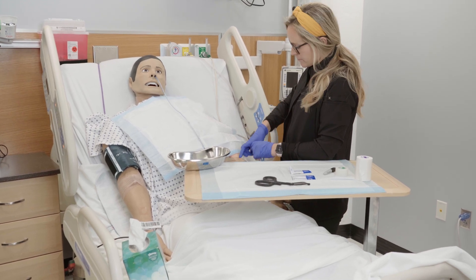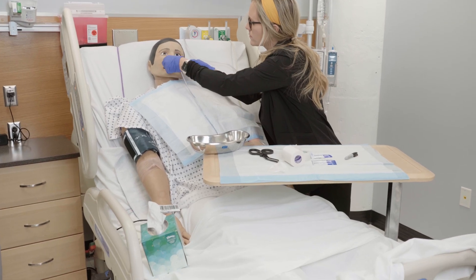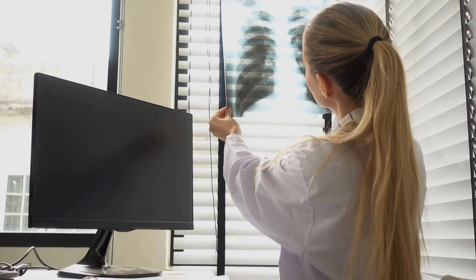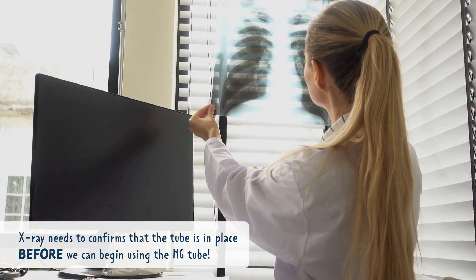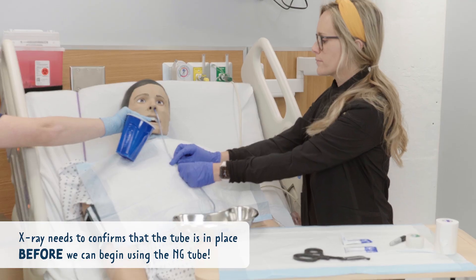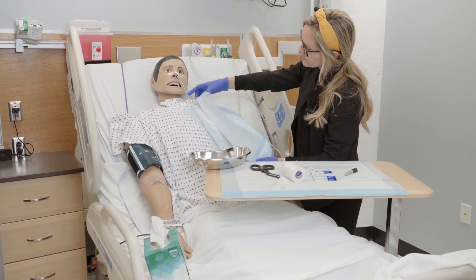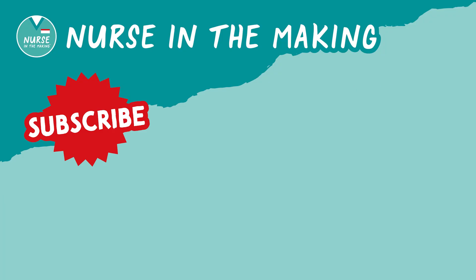Clamp the tube and secure it with a nasal bandage so it doesn't move around. It's important to know that an x-ray needs to confirm the tube is in place before we can begin using the NG tube. And that's how you insert an NG tube. If you need more help with nursing skills like this, be sure to check out these videos.